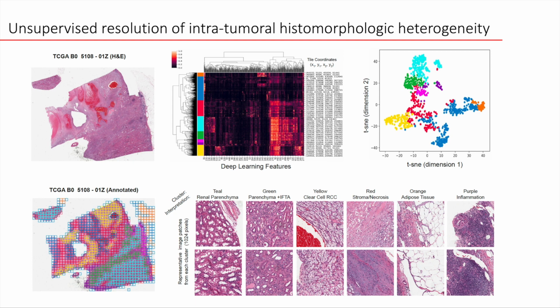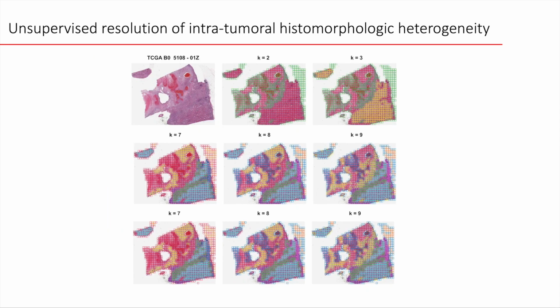So you can see we're able to, in a relatively automated way, without additional training, take a brain tumor-educated neural network that took many, many months to generate, and without any additional work, we're able to very precisely annotate this image. It's actually really interesting to go through the different subgroups to see how the computer organizes them, to see if it's doing this in a relatively intelligible way. And so instead of having 8 groups as what I showed you, you can actually cycle through the different subgroups and see exactly the decisions the computer is making to form these subgroups.